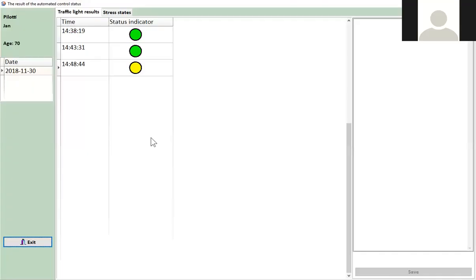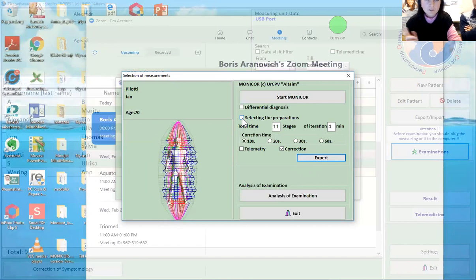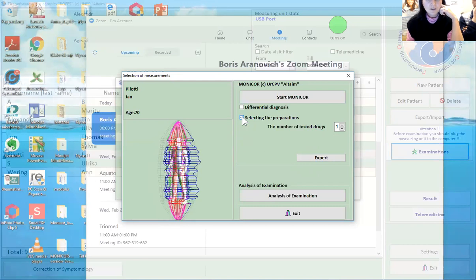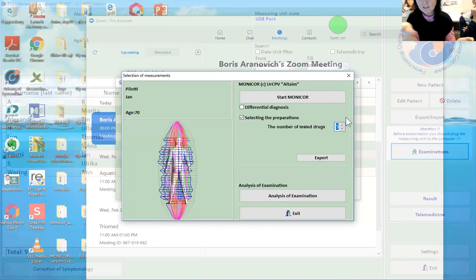Then selecting the preparations. This one also, I don't recommend you to do everything at the same time to the same client, because also when you check the fields, for example. So you just try this one, and here you write down the number of pills, it's up to 5. You can change how many pills you want to try on this client. So you write down pill number 1, like vitamin C, pill number 2, vitamin B.